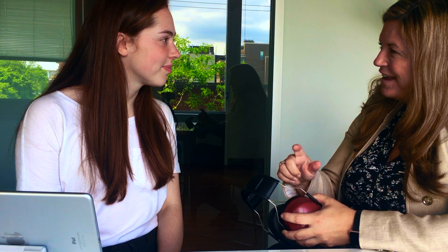Hi Emma. The test is going very well so far. There's a slight change that we're going to do now. I'm going to apply some wind noise on one side. I want you to try and ignore that noise and continue listening for the soft tones on the other side and continue the sorting task. If ever it gets too loud, let me know and we'll stop the test. It will only take a few minutes. Do you have any questions?